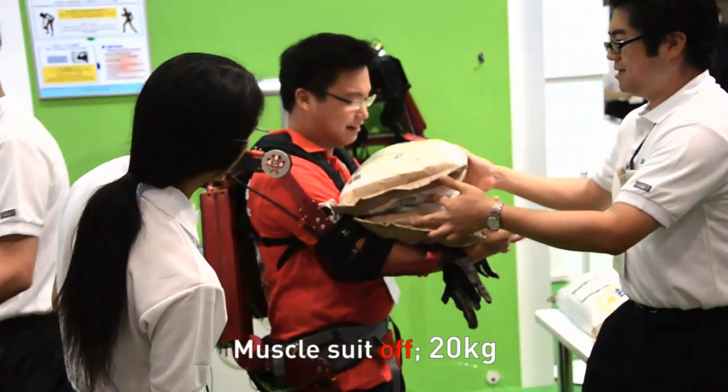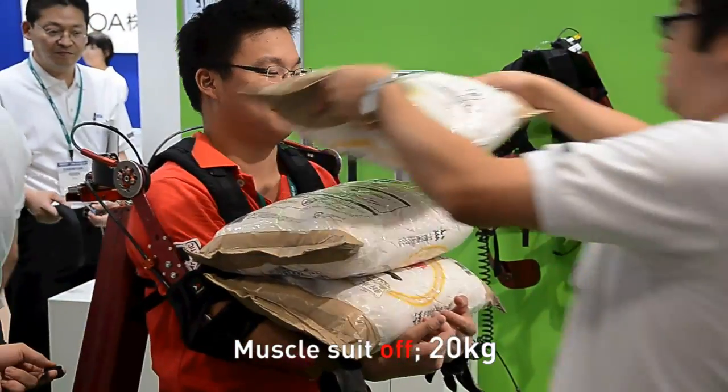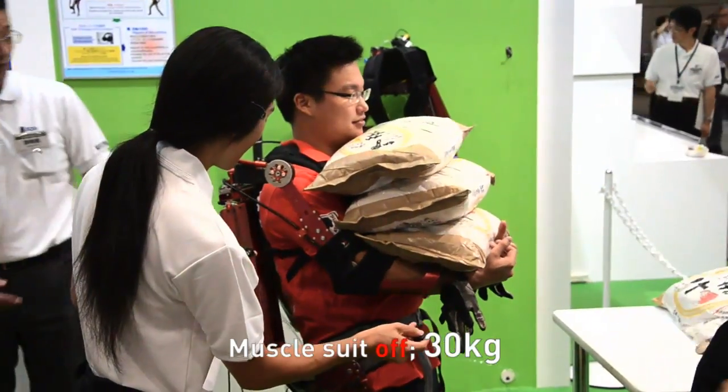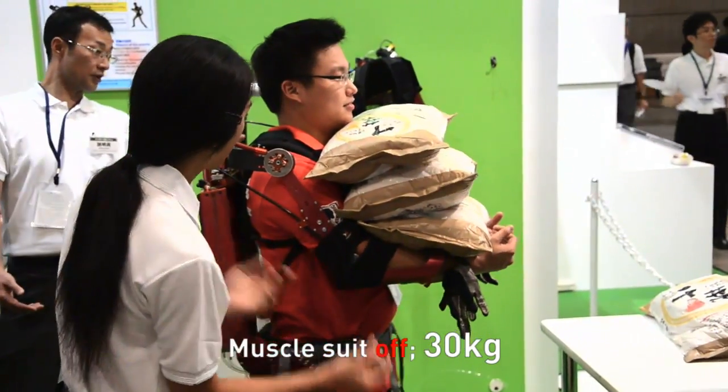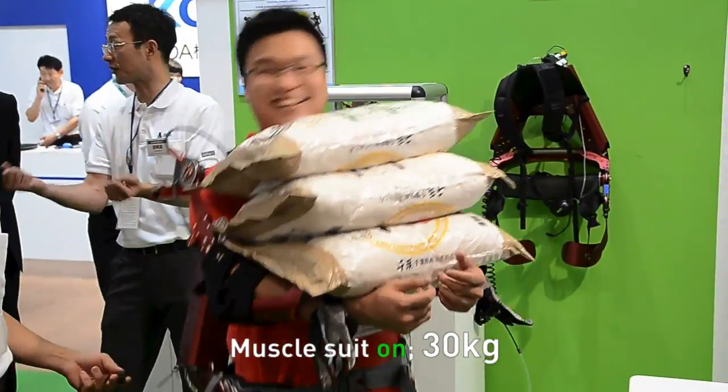We haven't switched it on yet. I can take another one — it's 30 kilos. Let's go, let's see. Yes! This is awesome.